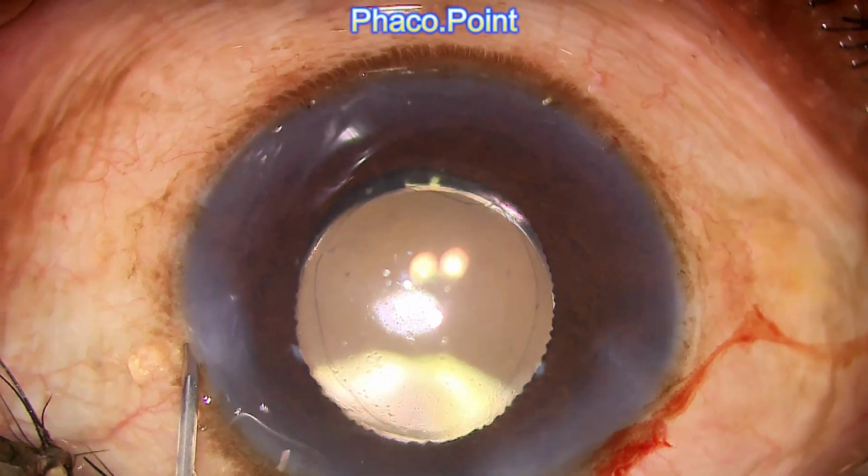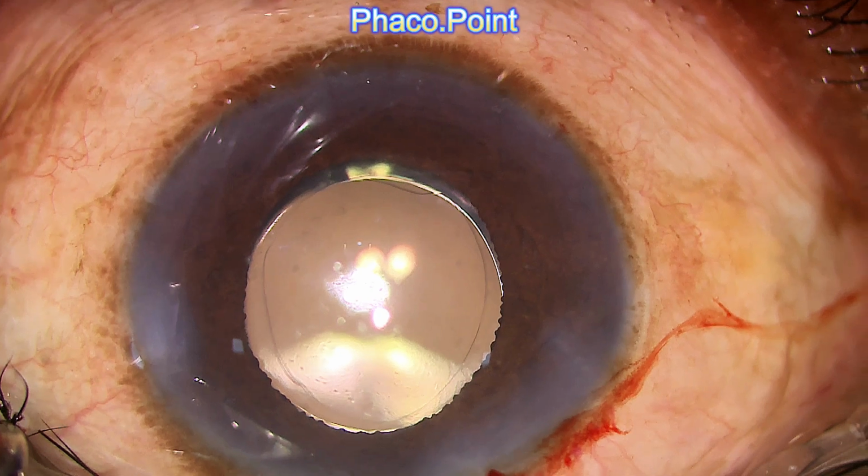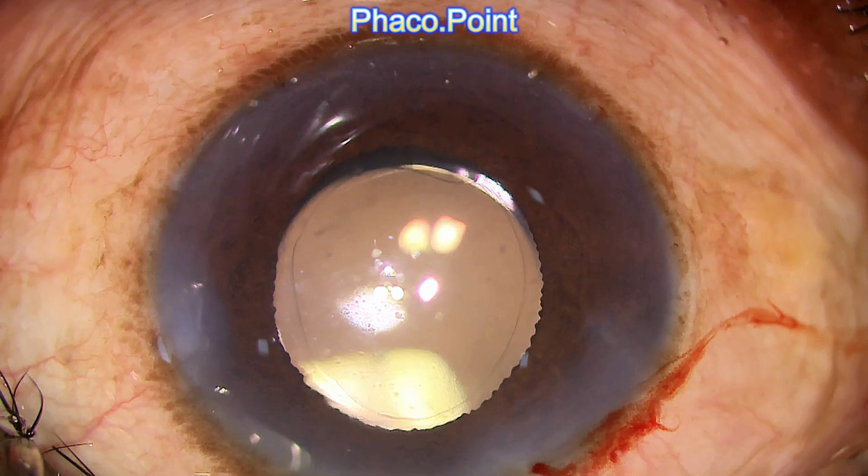I had to let out some fluid. So this is probably the explanation why all clear corneal incisions need not be stromal hydrated, because as we inject fluid through the side port, we indirectly create an internal stromal hydration that seals the clear corneal valved incision.